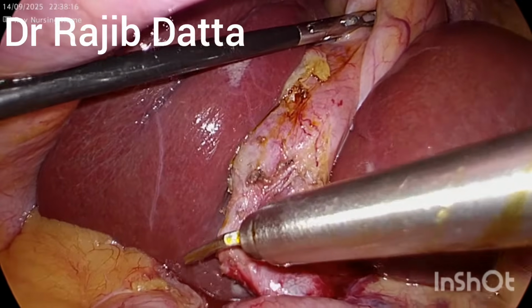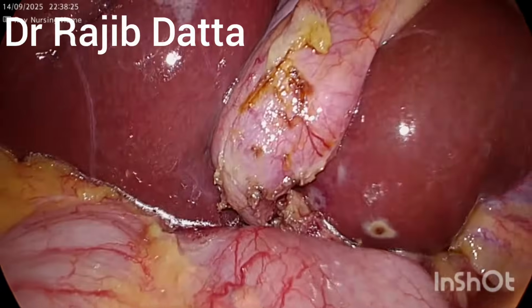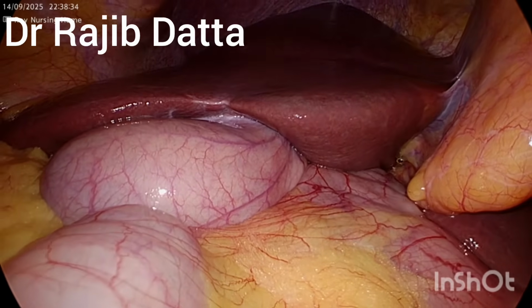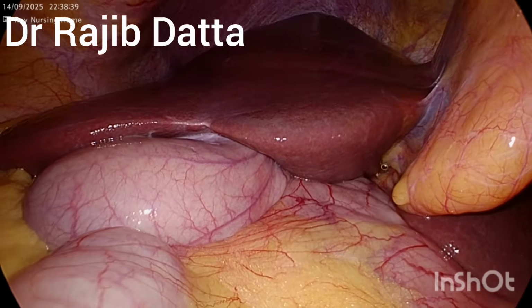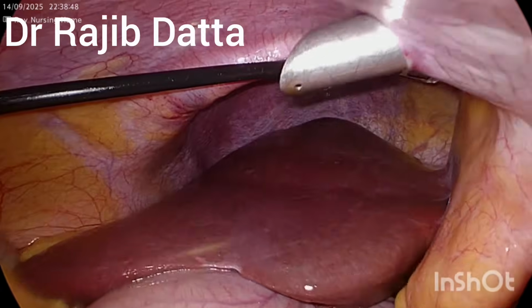So it is now being applied, and here you can well appreciate the color of the gallbladder wall and the lumen of the bowel. These are quite similar.